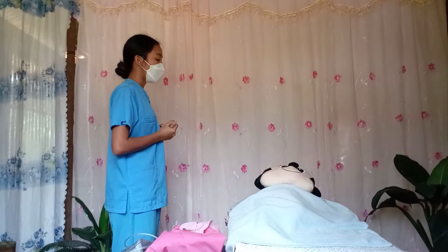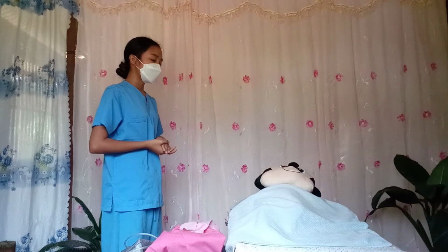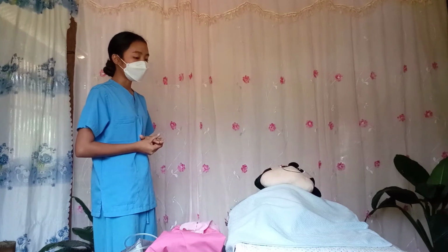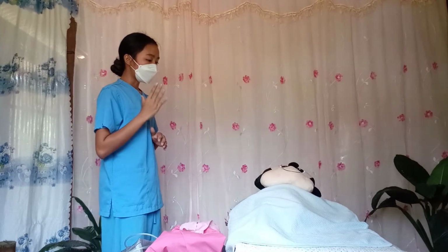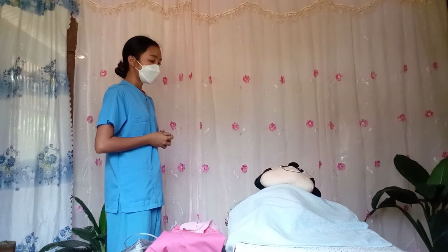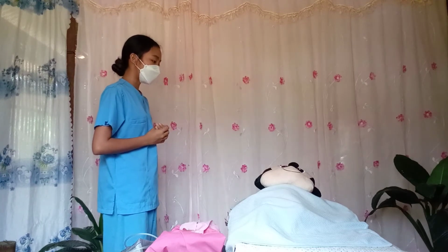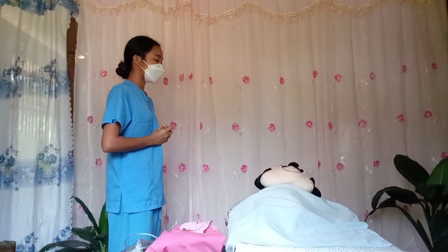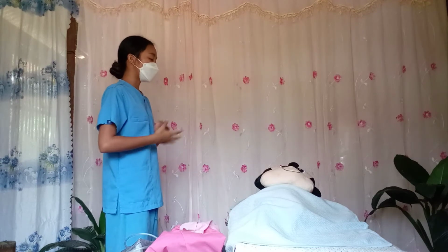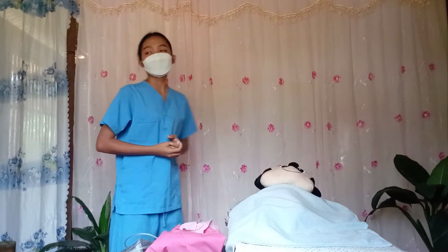Also in this procedure, I'll be exposing some of your genital area, and this is a little bit uncomfortable. You will also experience some pain upon the insertion of the catheter. But don't you worry, because after the procedure, you will get relief. Do you have any questions or clarifications regarding this procedure? Okay. Is it okay if I close the windows and curtains for you to have privacy? Thank you.